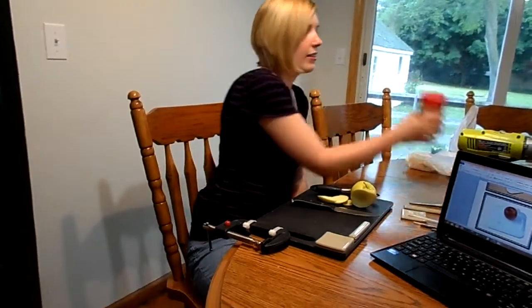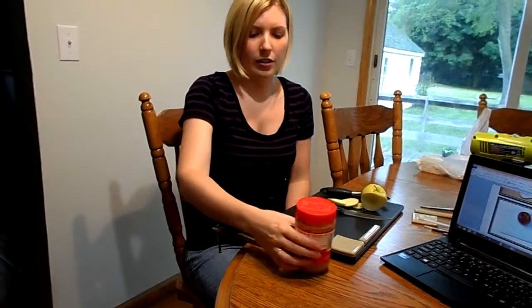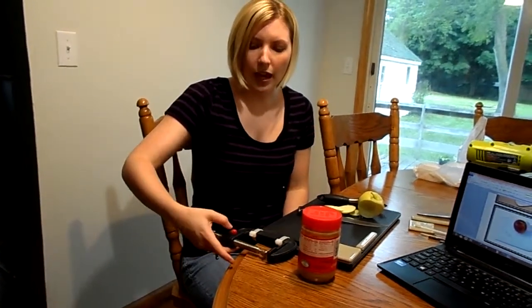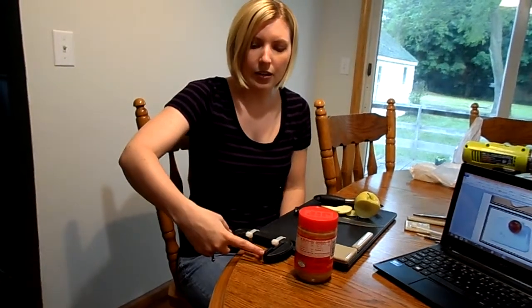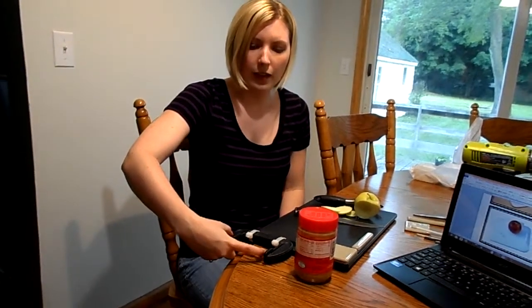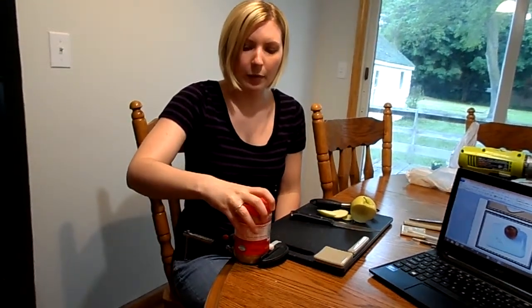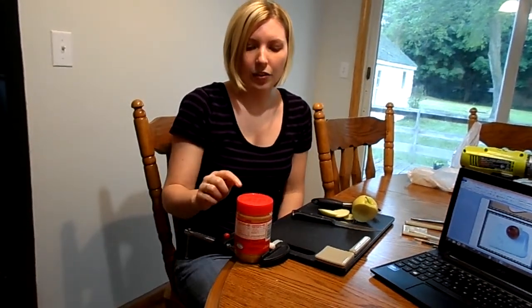Next, I want to open my peanut butter. So I need to go ahead and secure my peanut butter jar. So to do this, I'm going to use the clamp. I can do this with one hand by pressing the red button and using my index finger to open the clamp. I'll go ahead and place my peanut butter inside the clamp. And then I need to secure the peanut butter while I turn the clamp handle.